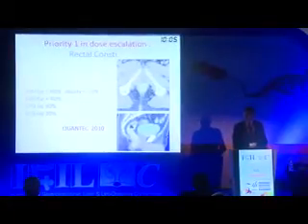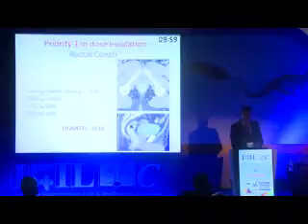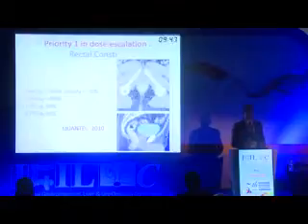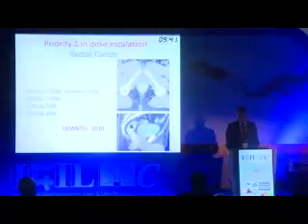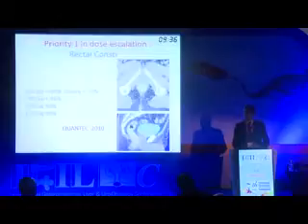So as you see here, the very close proximity of the rectum to the prostate, so you need to review these criteria. Not more than 10% of the volume of the rectum should receive 75 grays. We may apply 80 and 85 and 90, but this is very theoretical. We have to localize our treatment to the prostate without any injury to the rectum later. But if we cannot apply this dose escalation, we cannot counsel our patient.